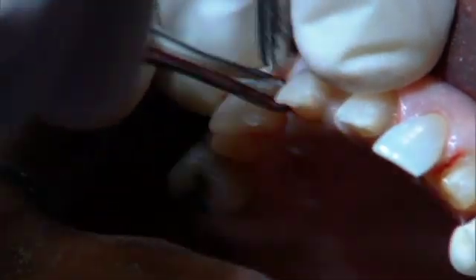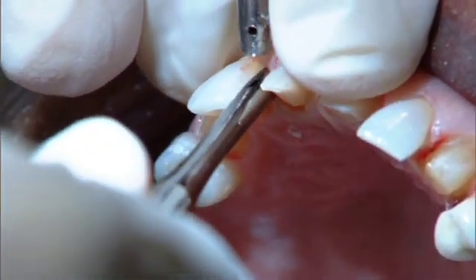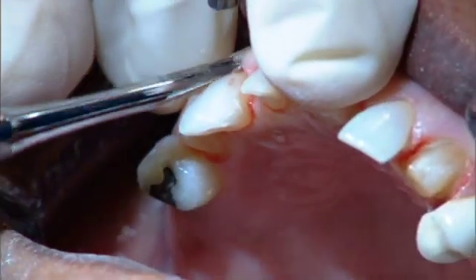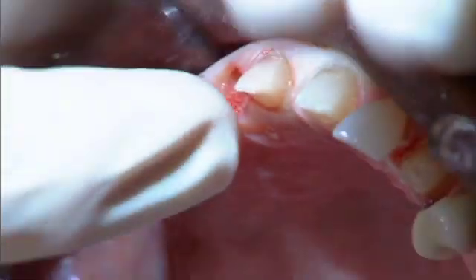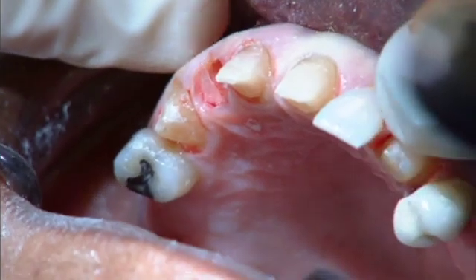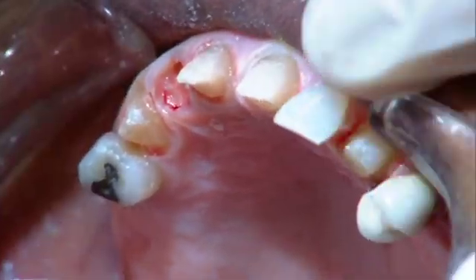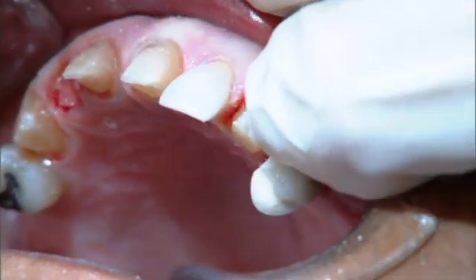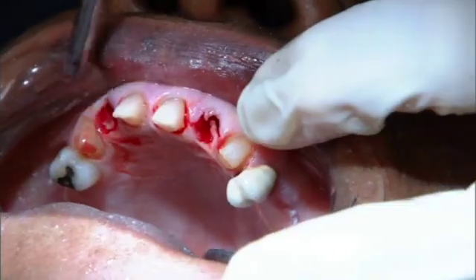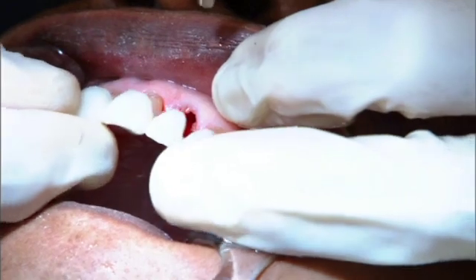Knowing all the while that there's no way to get a tooth out without using a certain amount of force. Okay, we were able to preserve almost all of the bone there, which is excellent. We'll jump to the other side now, and it'll be pretty much same song, second verse. Once we've got these teeth out now, we've preserved as much of the hard and soft tissue as we can.